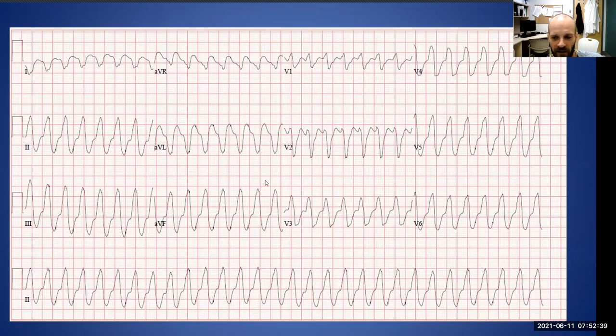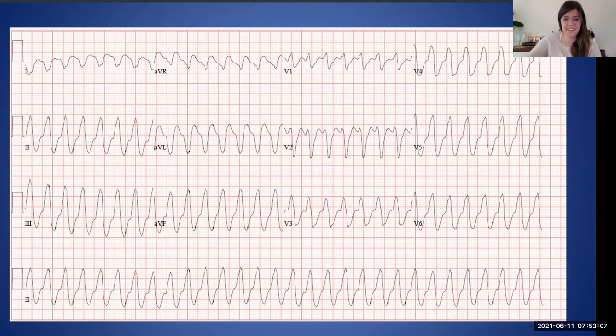Right. So our second ECG that we looked at. Can we explore the rhythm here? Lauren jumped way ahead and she gave us the answer right at the beginning of this when she was interpreting the trace. We talked before about how it was regular and fast, with broad QRS complexes. Every QRS complex looks the same, and we can't see any P waves. So what do we think the rhythm is here? VT. Nice one, Brianna. Very good. Yeah, so this is ventricular tachycardia. This is a monomorphic ventricular tachycardia.